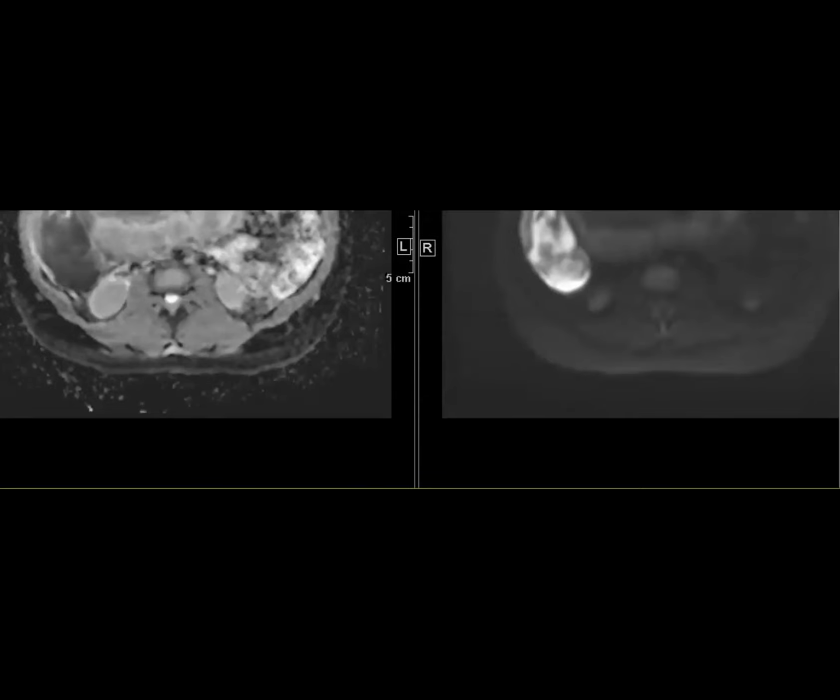I mean, we can see that it's a cyst, but it's just interesting that we didn't think that it was a cyst because of all the very irregular borders. We thought that it was just blood in the ovary. Okay, I'm trying to pull up the ultrasound without showing patient information. Hold on one second. That's why you're getting a blank screen here. The cystic portion was also restricting, which is kind of weird. The non-T1 hyperintense portions were restricting diffusion. Oh, it might have been ischemic, I guess, but they decided to save it.